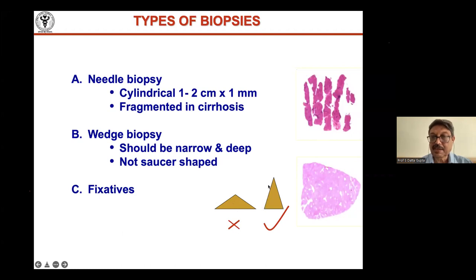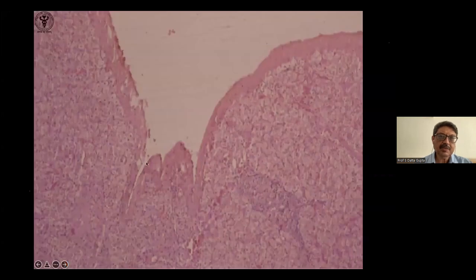And this is very important because our GI surgeons usually take a wedge biopsy along with the deeper needle biopsy when they do a shunt surgery, to confirm that it's not cirrhosis. And that's why a needle biopsy is looked at, and the wedge biopsy is deep enough. So you see, this is the subcapsular region. We have a thick capsule.